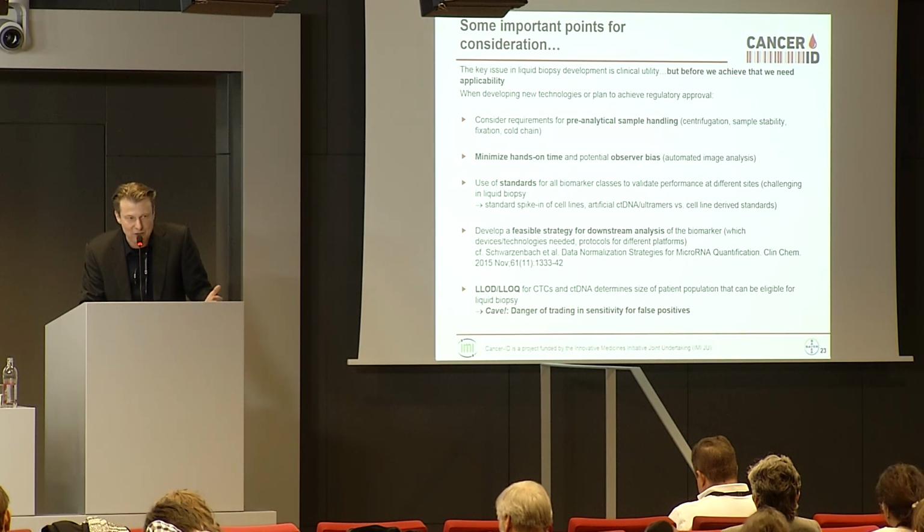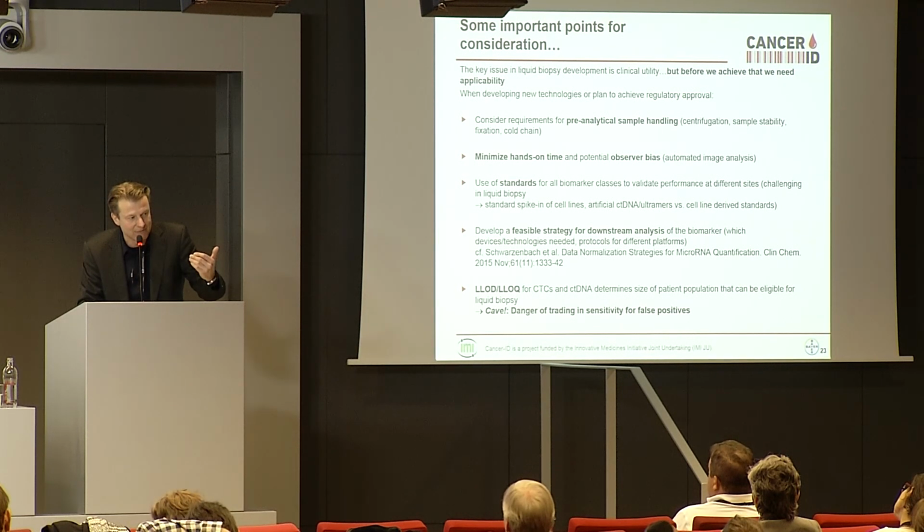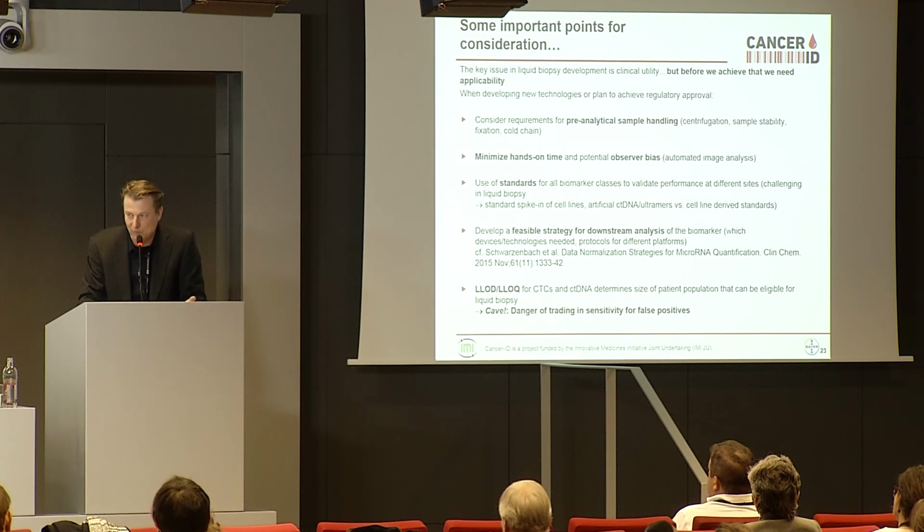I didn't touch on that too much, but the cost, of course, is also an important aspect, because if you think, for example, non-small cell lung cancer, the number of circulating tumor cells is really low. So what we do is we have this DLA procedure to have more cells. You need to enrich the cells, and then you need to basically get the single cell to get the information you're looking for. Is this a feasible workflow for a routine lab in the clinic, or is this a mere research kind of assay? I think from the cost, right now, the answer is quite clear. But we are really looking for assays that can be used in the clinic. So this needs to be the future development. And with that, I would like to thank you for your attention.